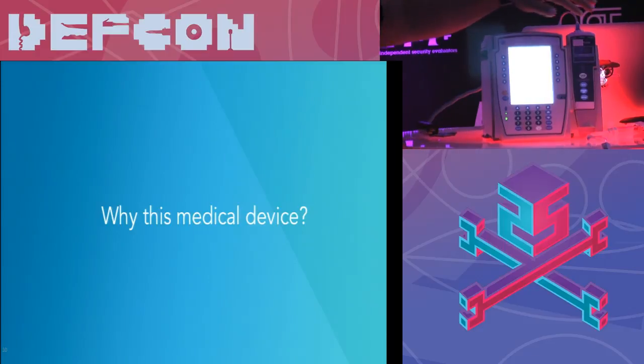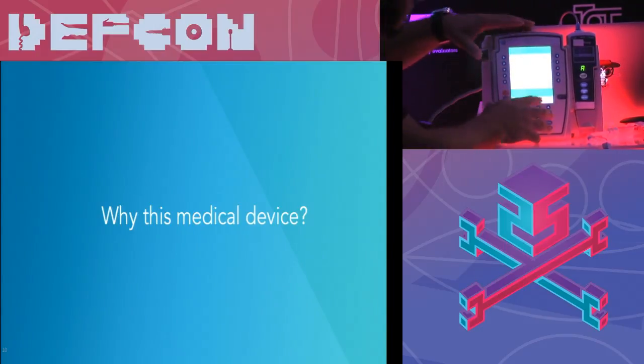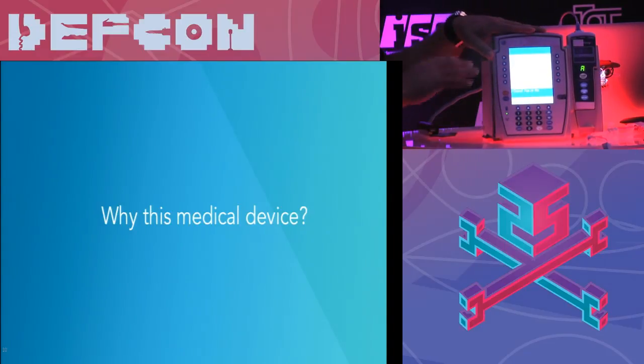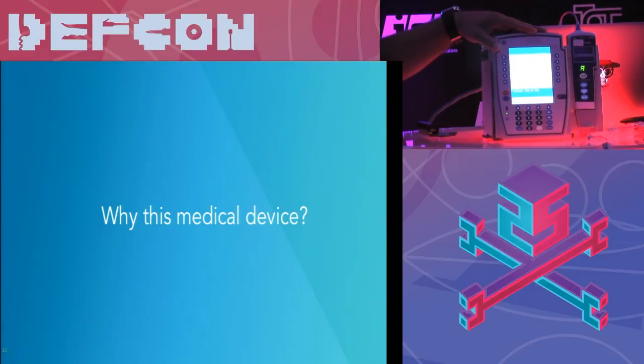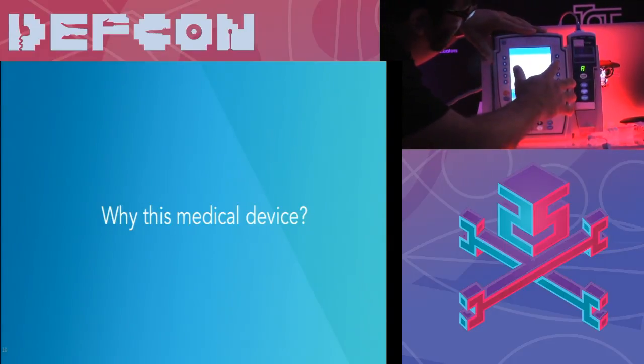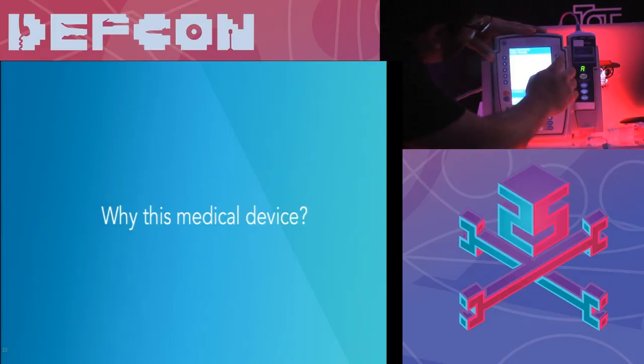This specific pump, you can have two on each side, so you can program many different infusions. Once it boots up, it is pretty simple. It's going to ask you for a new patient. You are going to see these devices going all around the hospital. If it is a new patient, you say yes, and you create a new profile. If it is not a new patient, it will load the profile of that specific person with all the medication listed for them.